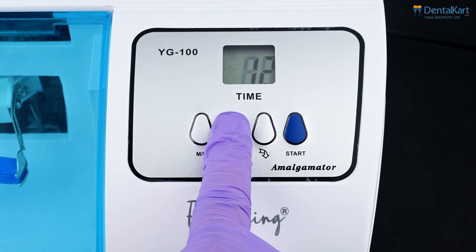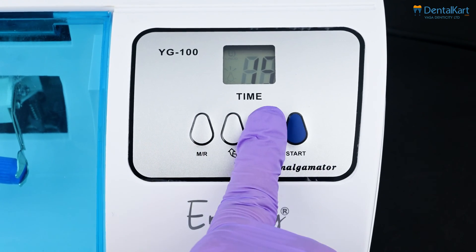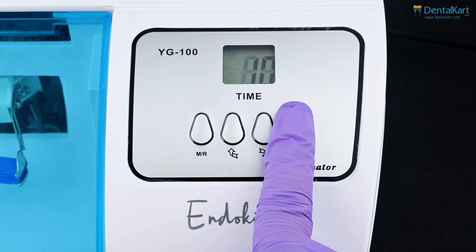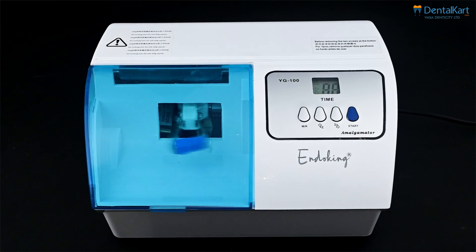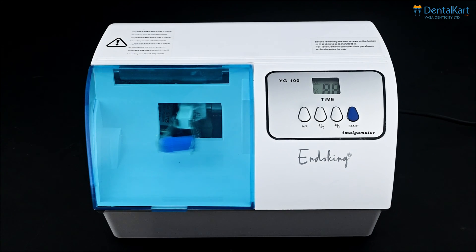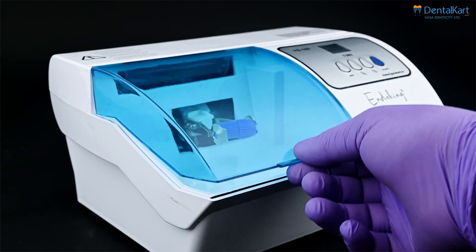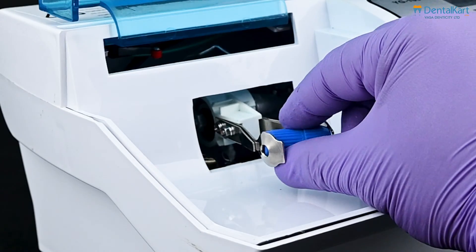To set the time, press the upper arrow key to increase the time or the down arrow key to decrease it. Once you've set the desired time, press the start key to begin the mixing process. If you need to stop the amalgamator at any time, simply press the start key again. Once the mixing is complete, open the cover and remove the mixed capsule.